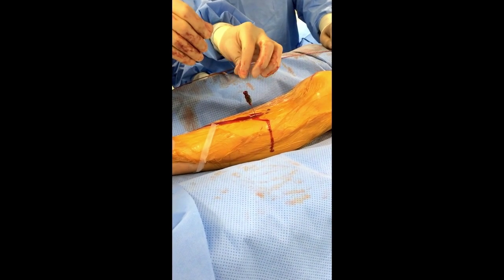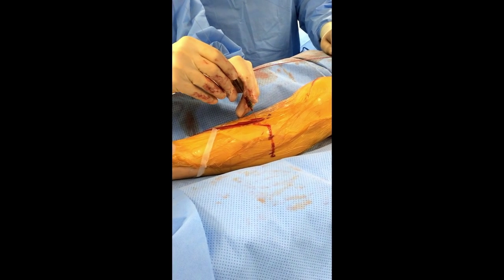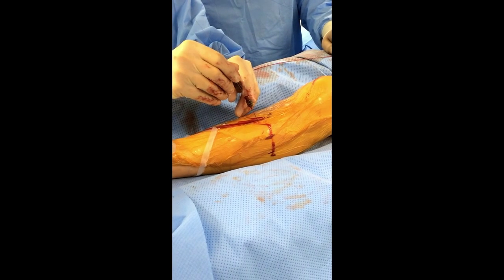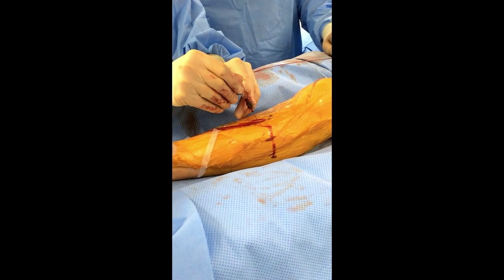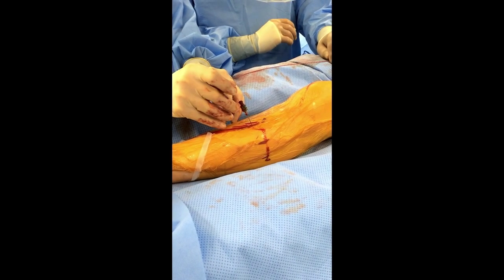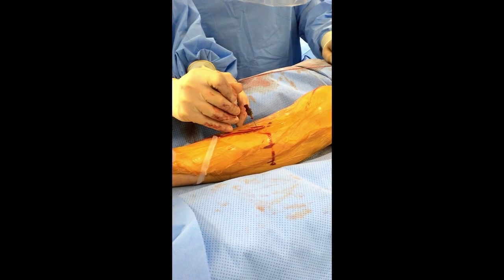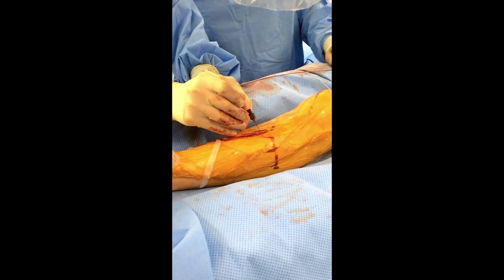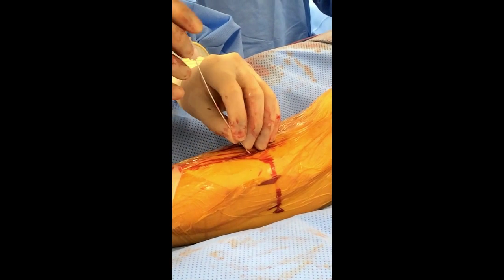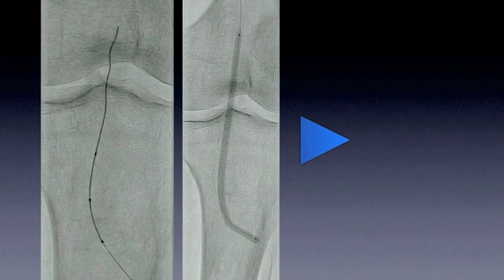Once you're there, ideally use a long wire — don't use a short wire. The long wire can allow you to start your procedure already. Although, if you don't have a long landing zone, then it's better to use a short wire that has good support. Once the wire is safely across the lesion and into the artery, which you can confirm fluoroscopically, at that point you just secure your pedal micro sheath and then do the intervention.